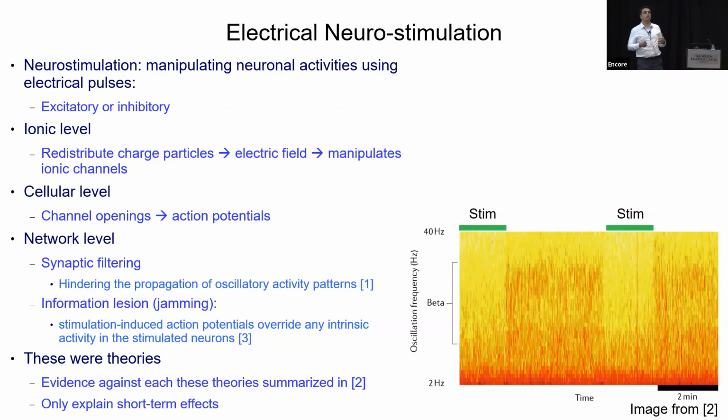Of course, these are all theories, and this is an active area of research. They only explain the short-term impact of electrical stimulation, and the long-term effects have their own theories. It's a little bit outside of the scope of this tutorial, so I'm going to leave it at this point.